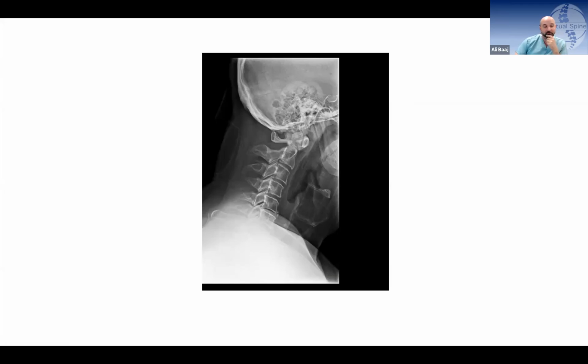But I may be wrong. That's tough to tell. No, I think that's okay. I think it looks the same, just a different, the head is in a different position because it's an X-ray versus CT when they're laying down. And this is probably standing, right, Nader? Yes, that's standing, upright X-ray, yep, with an Aspen collar.